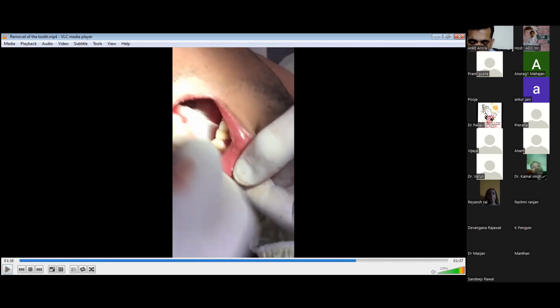So the key takeaway point is, when you remove the third molar, if you are applying the fulcrum, the tooth has been elevated 1 to 2 mm from its socket or its pre-existing original position. So you need to take advantage of that position: put your fulcrum slightly deeper, and dig more with the elevator, or you can change the position with a broad base.